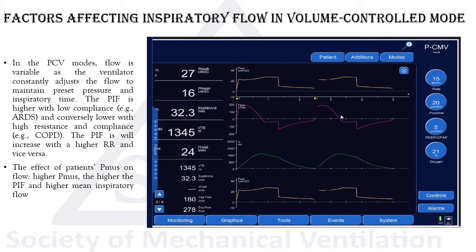he's working hard. Actually, we're trying to work on a formula calculating the mean inspiratory flow, or the area under the curve of the inspiratory flow, to determine if that could be used as an index of the patient passing or failing the weaning.